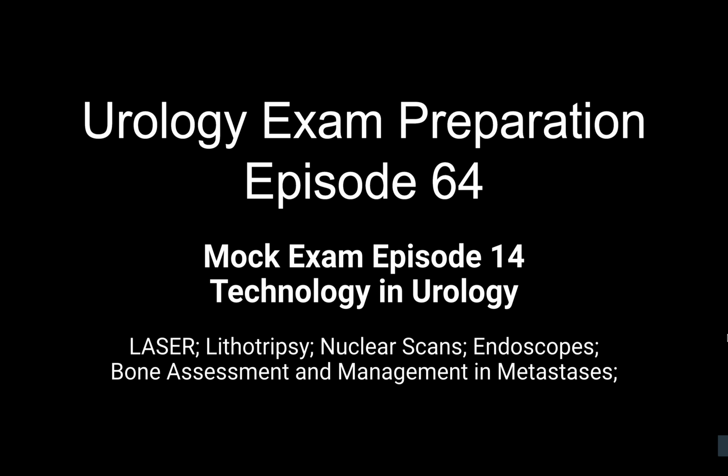Instead of listing the patient for the stent removal, you can just use a digital scope. It can be taken anywhere with a small monitor which is almost the size of an iPad. It's very useful if a patient comes with urinary retention in A&E or in the surgical assessment unit, where you can take the scope to do a camera test, not only to assess the hematuria, which can be done even later, mainly for placing a catheter if there is a stricture, or a difficulty in guide wire based catheter placement.